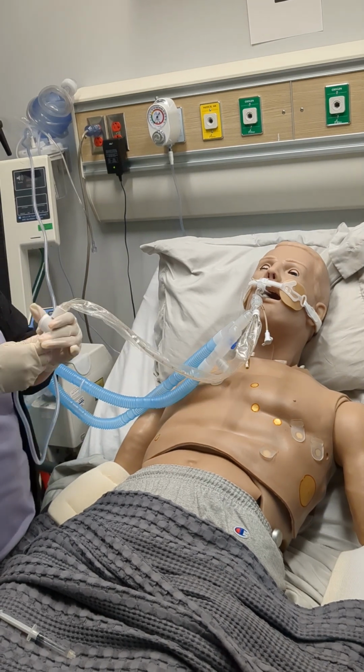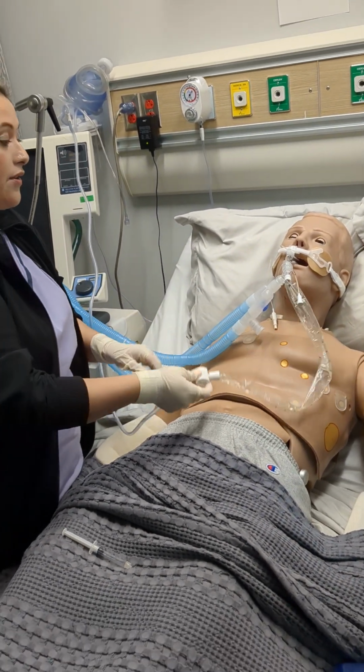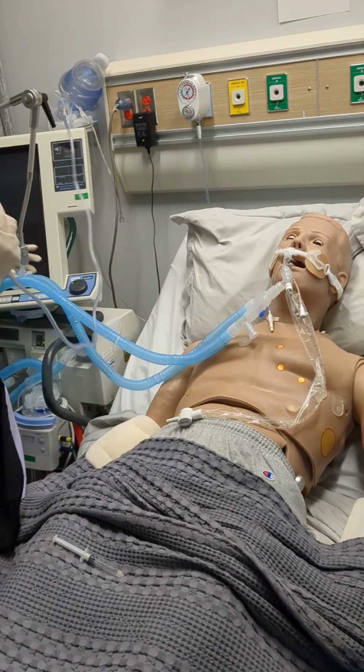So you disconnect. Do we have to hyperoxygenate? Yes. You have to make sure you still have oxygen. That's why we put it at 100.